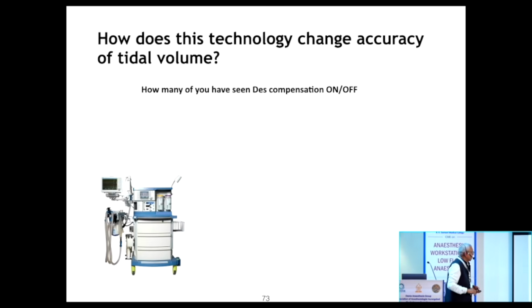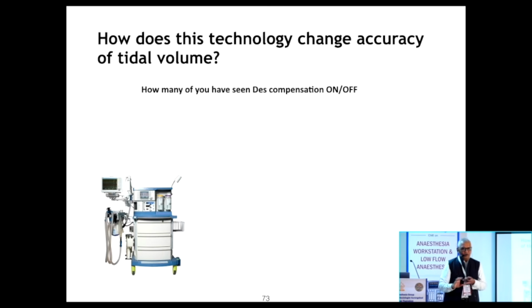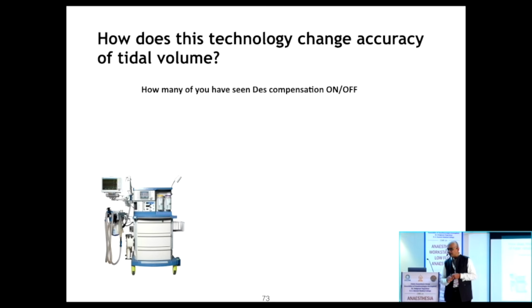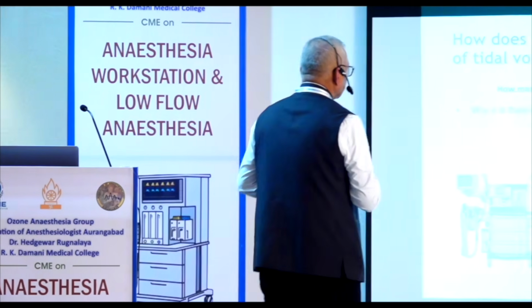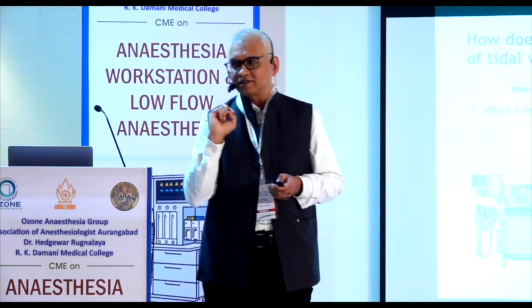Now, has anyone seen DES compensation? Do you use Desflurane? Okay. You are using the Draeger Fabius machine, I hope. Yes. Have you seen there is something called DES compensation? What does it mean? The DES compensation is because the Desflurane vaporizer is a heated vaporizer.